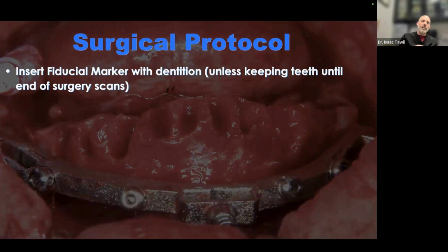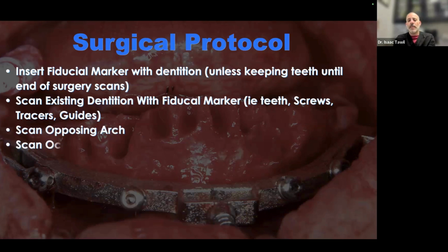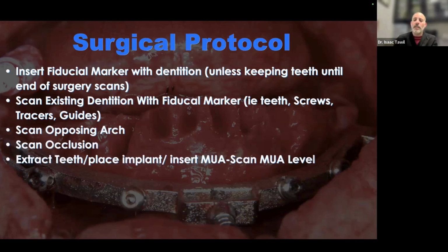So the surgical protocol involves inserting a fiducial marker and then scanning that to the existing situation, whether it's a denture and you carve a hole in the denture and capture that fiducial marker, or whether you're going ahead and matching it to teeth. We also have within the software an internal scan. We can scan the intaglio of a denture and match it to tissue, but that doesn't help me if I'm going to destroy the tissue, right? So it really does need something that's going to be there from beginning of surgery to the end of surgery.